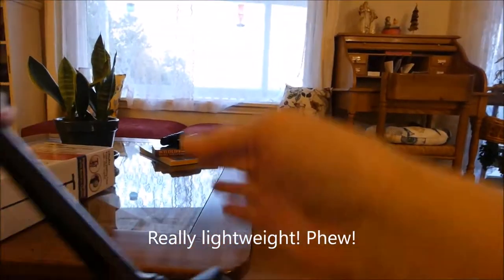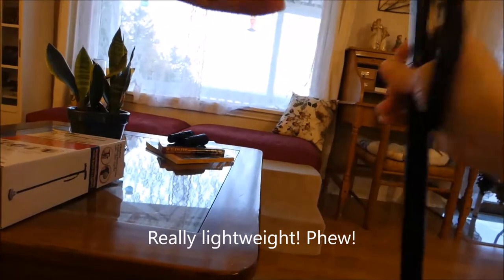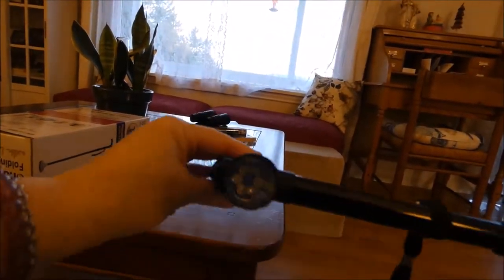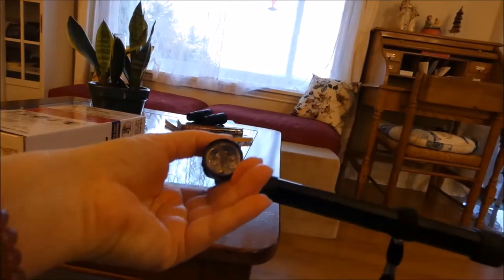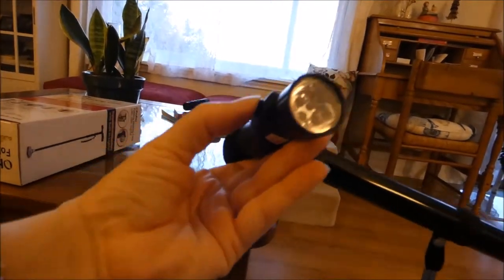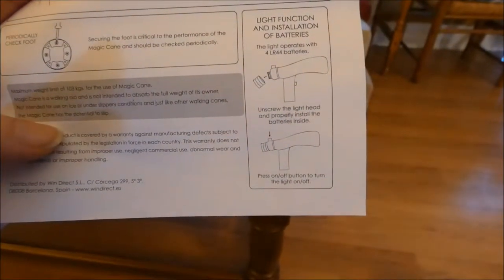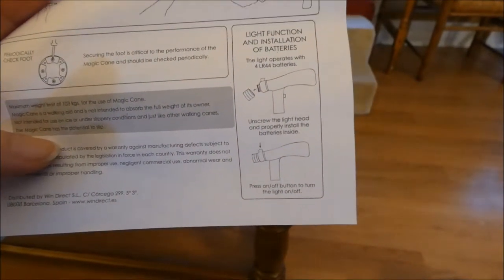That is what the bottom looks like. That's the handle — it has an LED flashlight with a little button on top. Really easy to press. It needs four LR44 batteries.